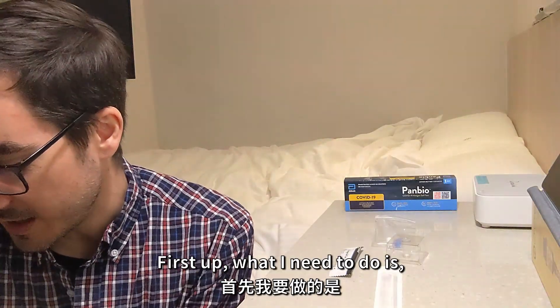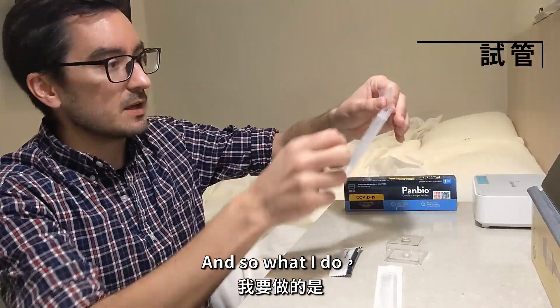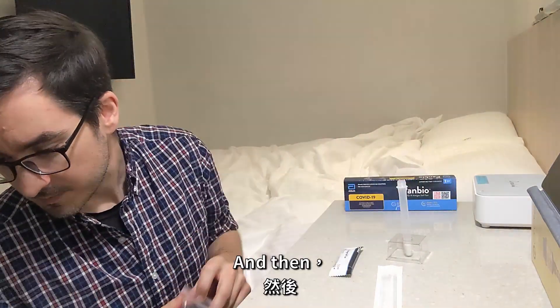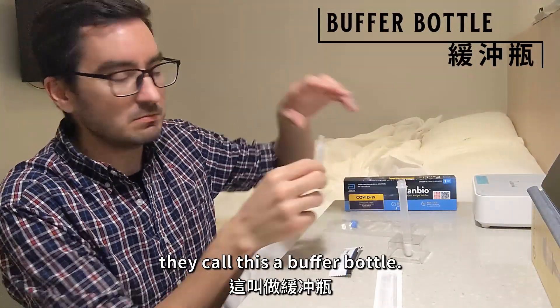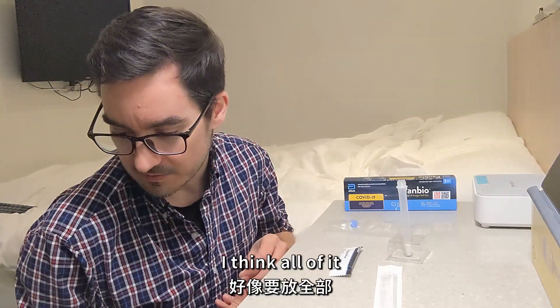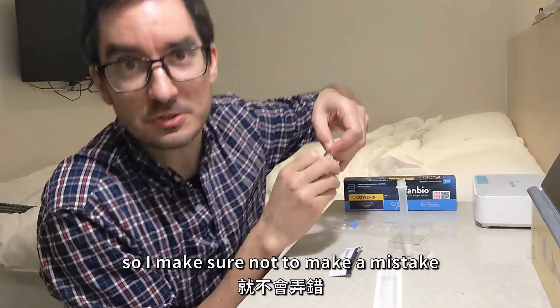First up, I need to prepare this vial. So I have a bottle in here — they call this a buffer bottle. It's a bottle of liquid and I'll have to put some drops into this vial. I think for this test you put all of this liquid inside. So I'll take my time and make sure not to make a mistake.